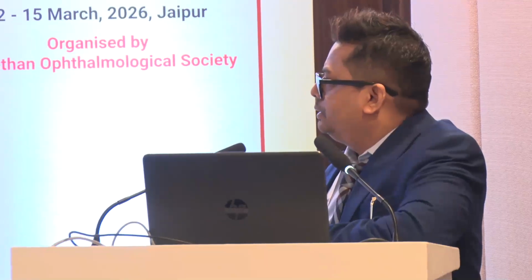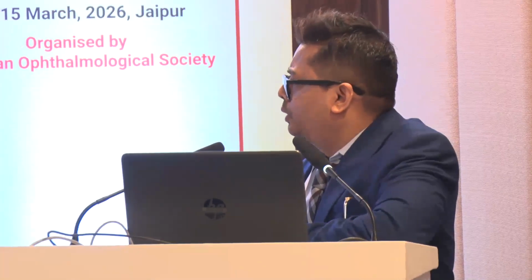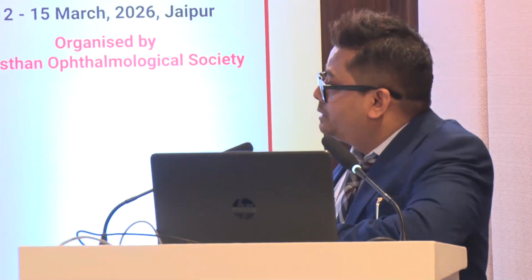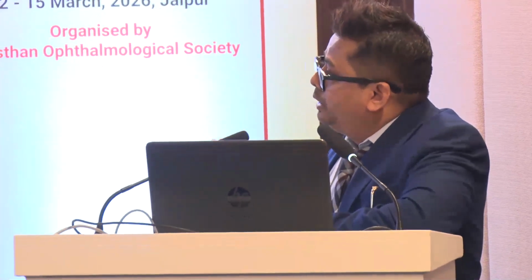So that indicates it definitely has some role, and that is the message we convey in the study. These patients had poor compliance, because some had anisometropia of -6 or -7, and were suspected amblyopes, with probably only 1 or 2 lines of improvement by BCVA or RGP. When you place the phakic IOL they definitely have more improvement than whatever BCVA they had. But further, there is an average of at least 1 or 2 lines of improvement during follow-up from 3 months to 6 months or beyond.